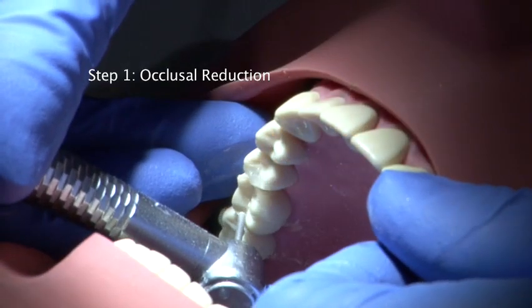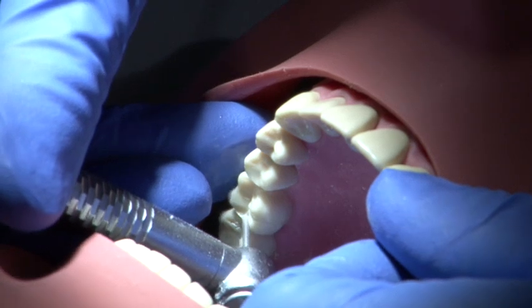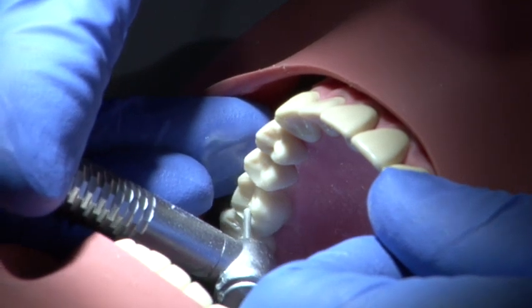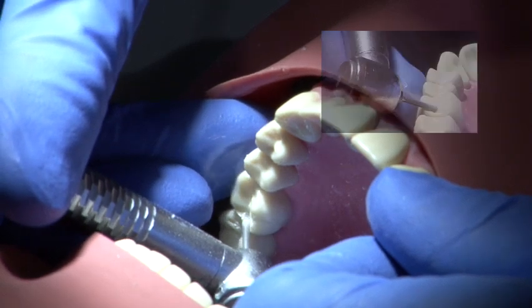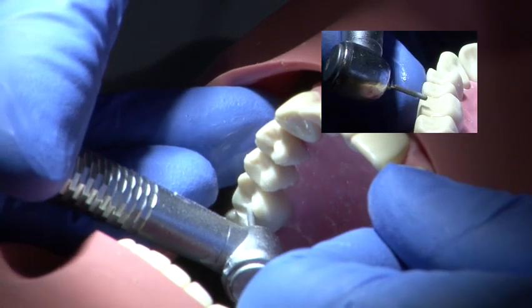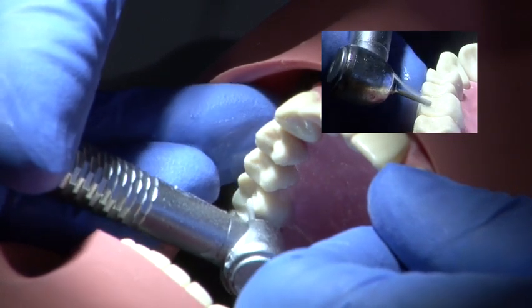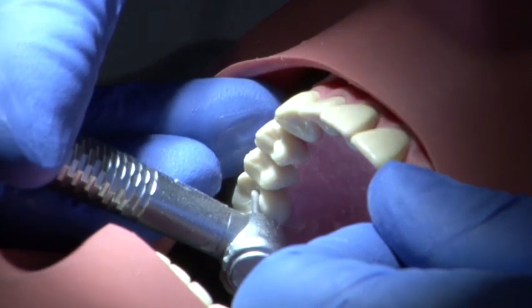The first stage is occlusal reduction. Using a parallel sided medium grit burr, prepare the occlusal surface to a depth of 1mm for metal. Follow the cusp outline so that you maintain the form of the tooth, and use a smooth continuous action supporting your burr hand freehand.